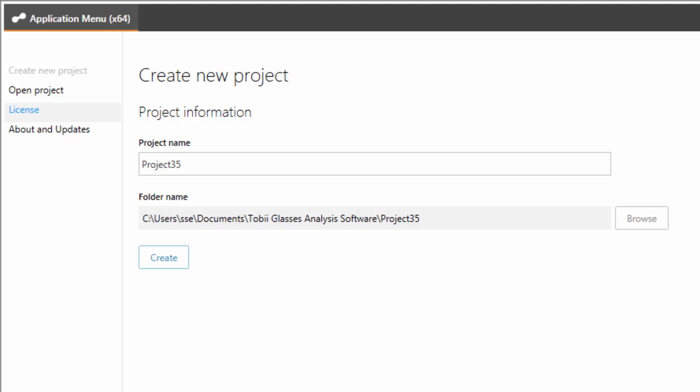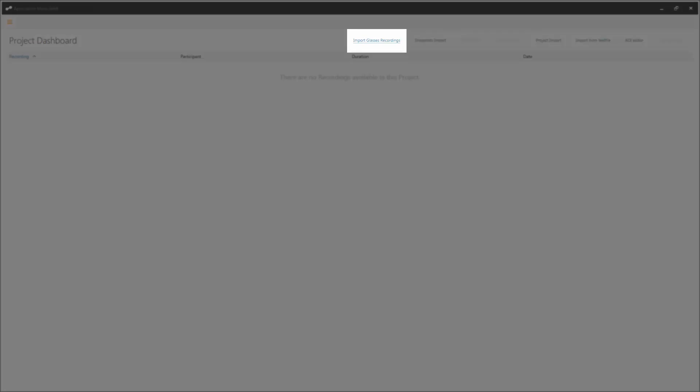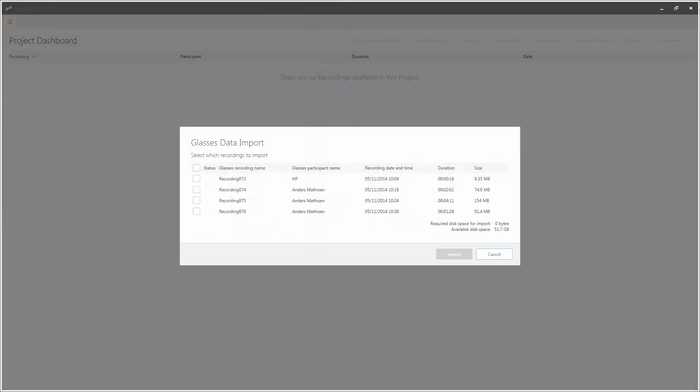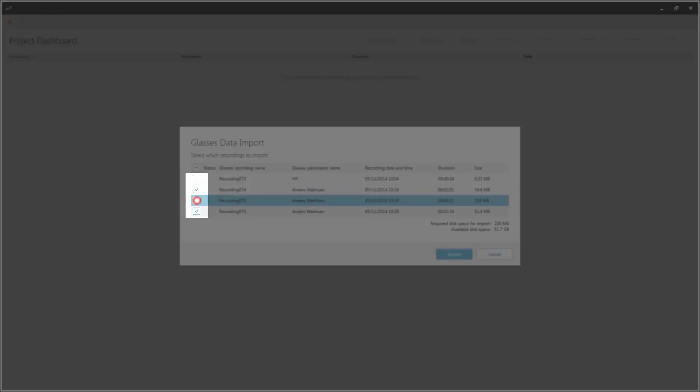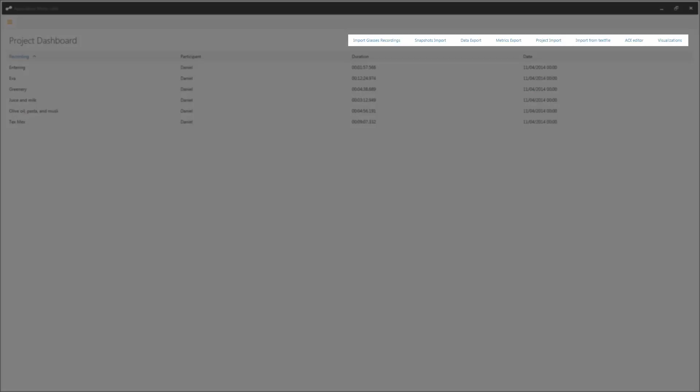Remove the SD memory card from your recording unit and insert it into your PC. From the project dashboard, click on import Glasses recordings. Locate your SD memory card and click on the .ttgp file to import the data. Select which recordings you wish to import by clicking the checkboxes next to the appropriate recordings. Once recordings are imported, I can show you the basic features of Tobii Glasses analysis software. These include a snapshot mapping tool, a visualisation tool, an AOI tool, as well as metrics and data exports.